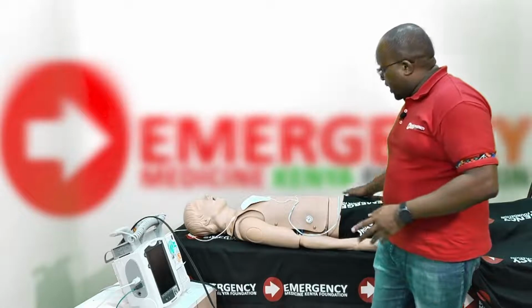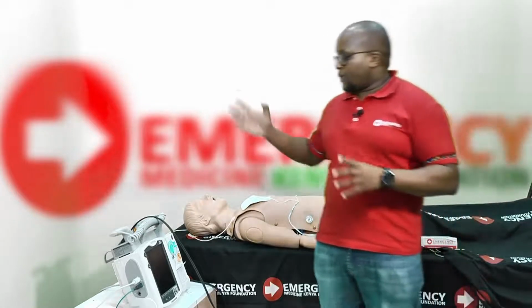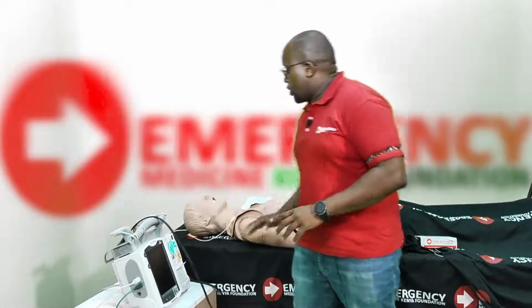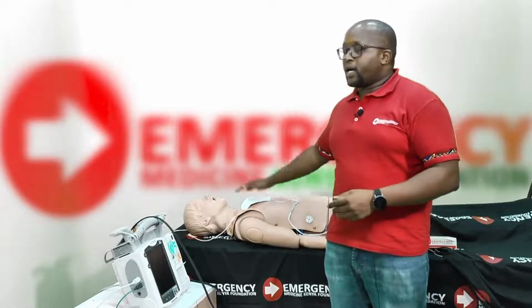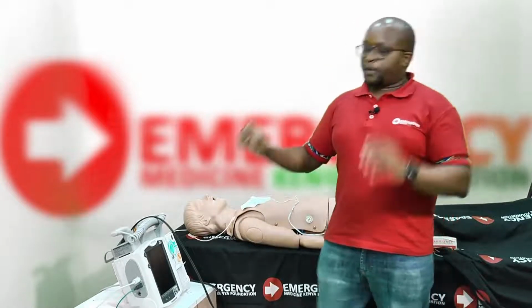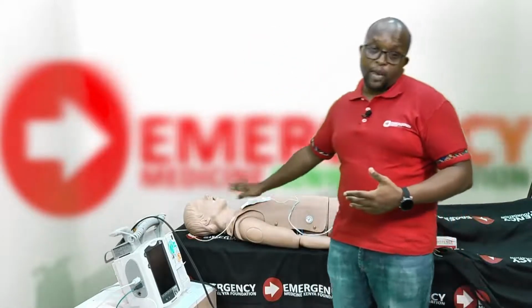So we have our patient here. Now, the other difference compared to defibrillation and cardioversion is that pacing is only possible using pads. You cannot pace a patient using the paddles. You have to use pads because the machine needs to read the patient's own rhythm and at the same time provide a pacing rhythm to the patient. You can't do that with paddles. Paddles are good for defibrillation and cardioversion, but for pacing, you definitely need to have pads available.